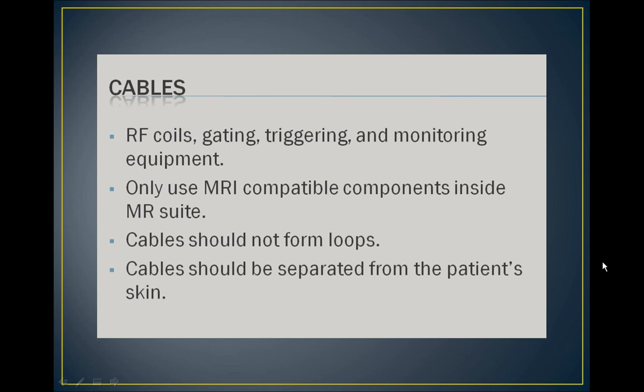We have to be very careful with the RF cables in the MRI scanner. Coil cables and coils used on monitoring and gating equipment should be shielded and grounded. Any loops in a cable can cause an arcing effect to occur, and the patient could be harmed. Cables on all system components need to be inspected routinely for breaks in the insulation.